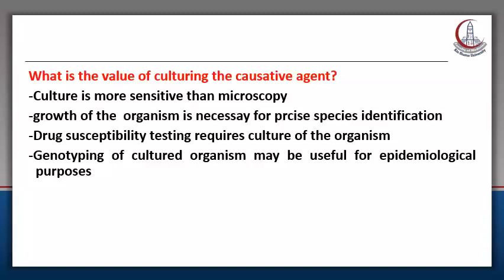The last benefit of the culturing system is to perform genotyping for cultured organisms. If we have a colony on the culture media, we can do DNA sequencing for these organisms, and this will be beneficial for epidemiological purposes, to know if these strains are similar in their DNA sequences in different patients and in different sites.